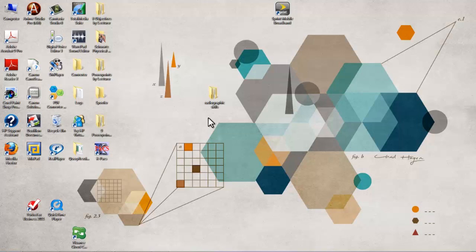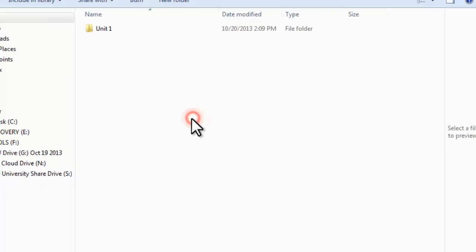First, we click on the folder Radiographic Skills. I have placed this folder in the center of my desktop. Double click.